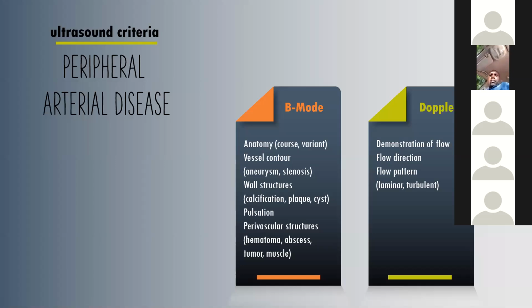So how can we confirm? In laminar flow you will get a solid color, red or orange, and it would be solid, with no mosaic pattern. But if it is turbulent flow, then you will get different colors mixing, maybe red, blue, green mixing. That's called mosaic pattern flow.